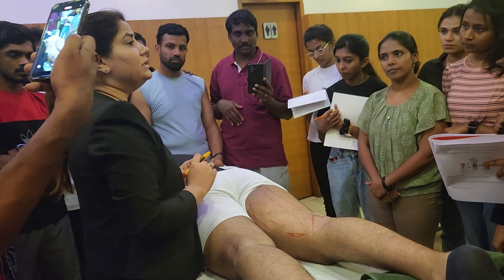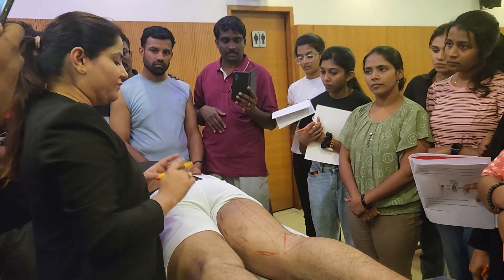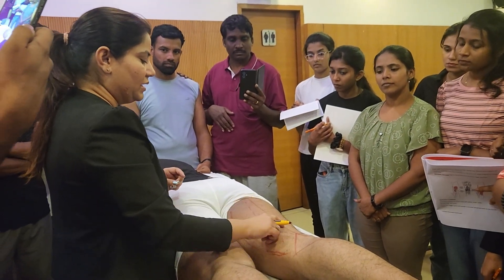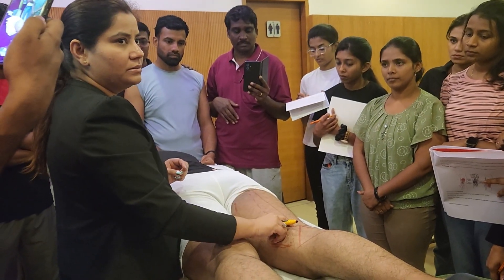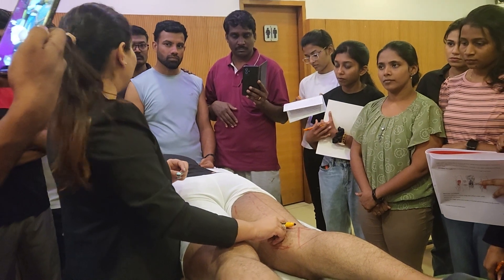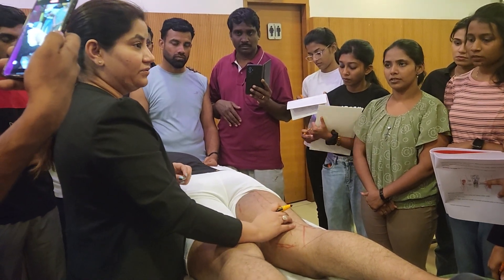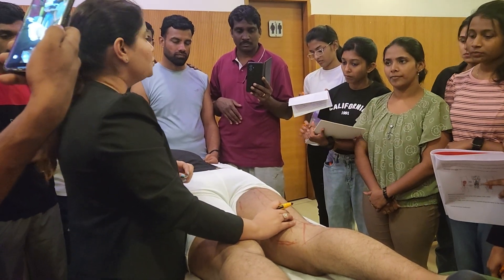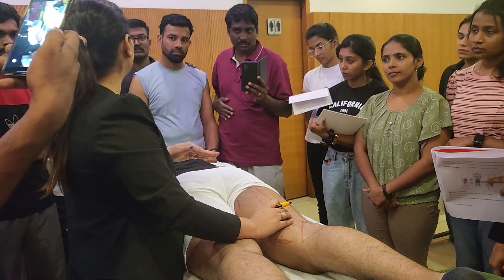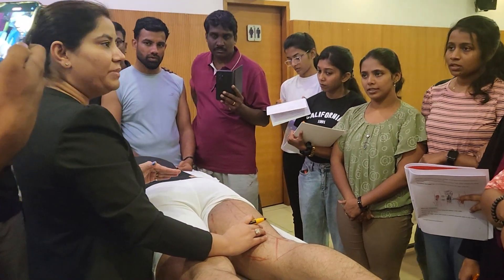Whenever you needle the hamstring, you have to be very sure that you are not coming in the center. Why? Because that is the sciatic nerve. So always your needle will be away from the center, away from the midline.